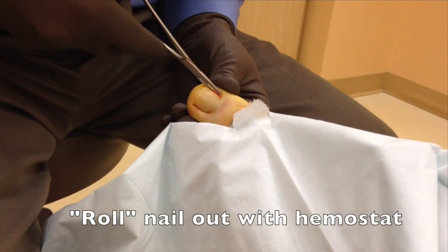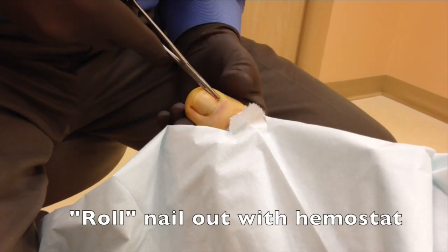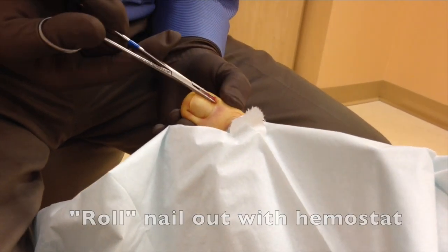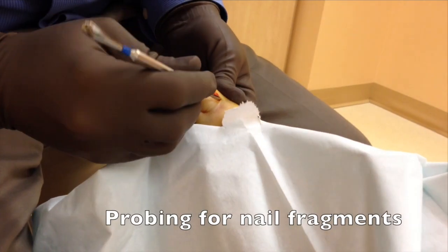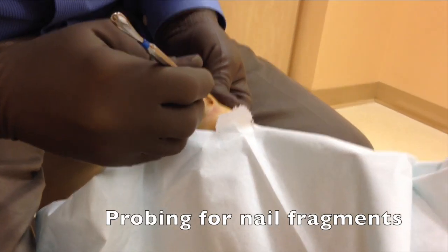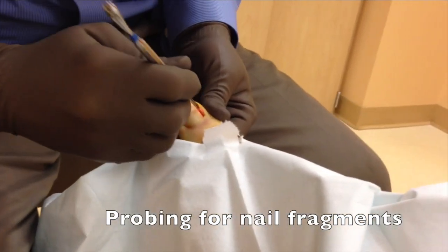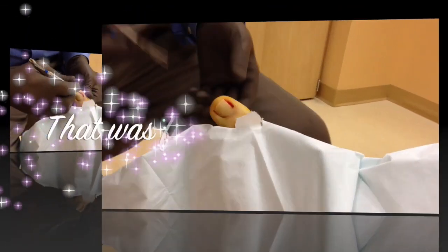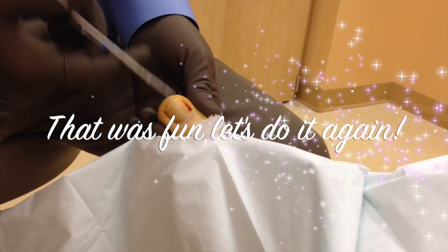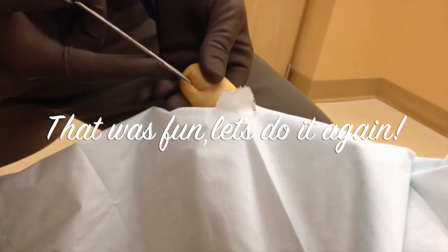Once it's cut, use the hemostat to roll the nail out. If you're not sure, you can probe for fragments to make sure there are no nail shards left. If needed, you can also do the other side.